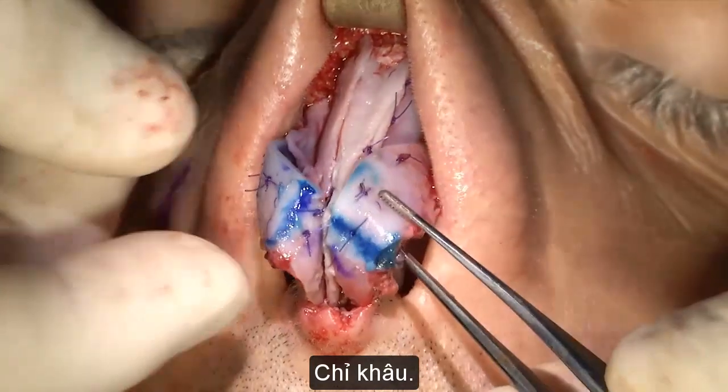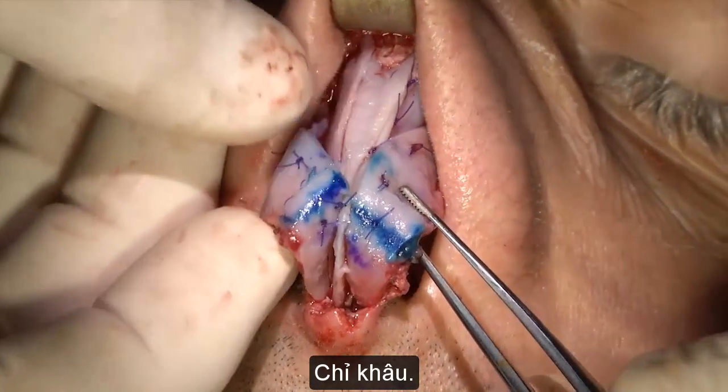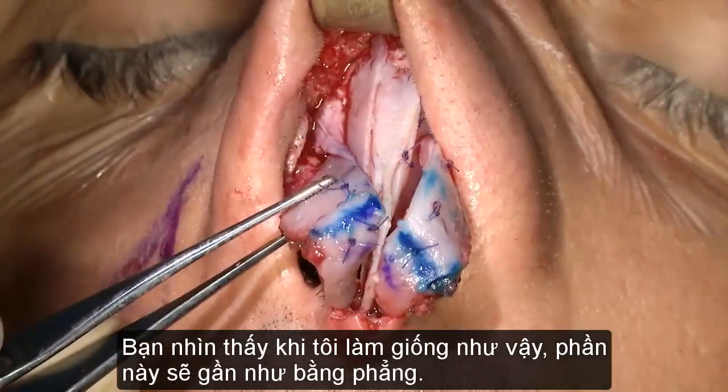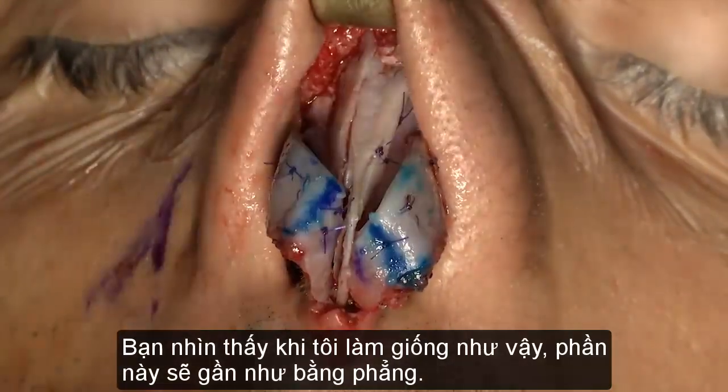Suture. You see, when I will do this, this thing will be almost compensated. I will probably strut it.